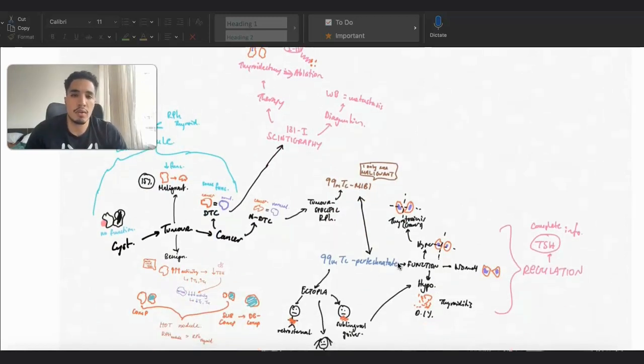So we've essentially got two main radiopharmaceuticals, which are basically the substances that the patient takes, for example, into their body, and then we can track it using gamma cameras, and we can track sort of the uptake, so how much of that pharmaceutical is taken in compared to the normal tissue. So we can either use 131 iodine, or we can use 99 technetium.